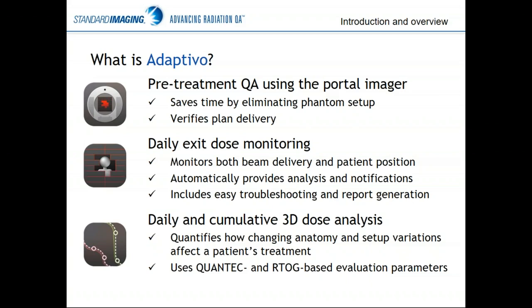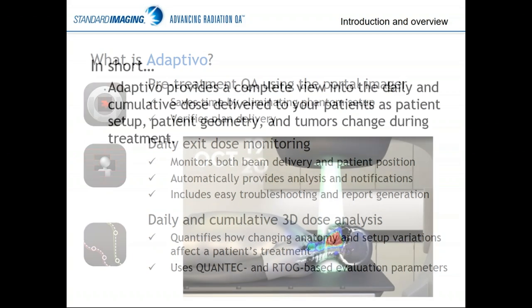The third thing that Adaptivo does is daily and cumulative 3D dose analysis. We actually calculate the 3D doses on the daily cone beam CTs, so you can quantify how patient anatomy changes or setup variations affect the quality of their treatment. We pre-program Adaptivo with QUANTEC and RTOG-based parameters for DVH analysis, but these are customizable for your clinic as well.